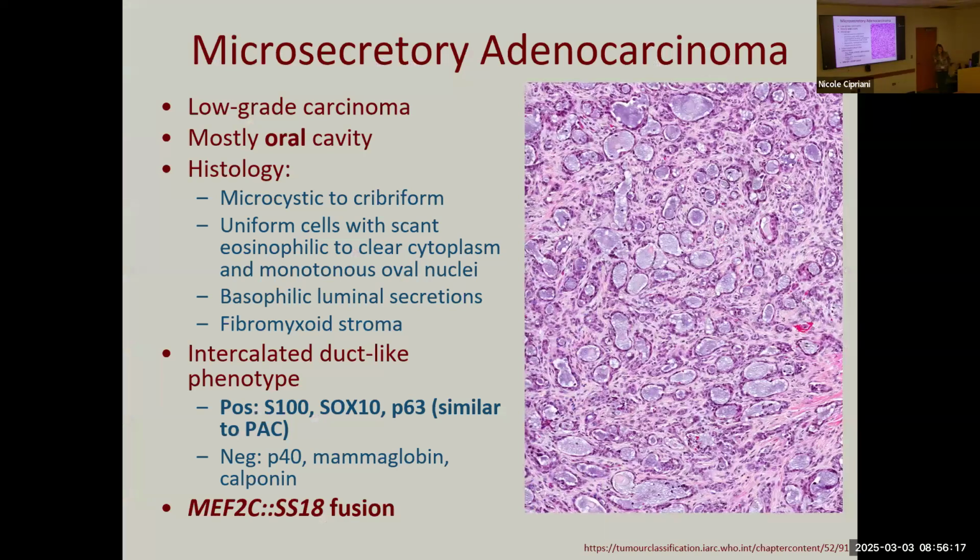Okay, microsecretory is yet different. This is also not biphasic, negative for P40, but again also diffusely strongly positive for S100 SOX10. But has this different fusion, this MEF2C SS18 fusion.